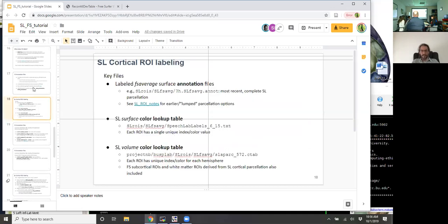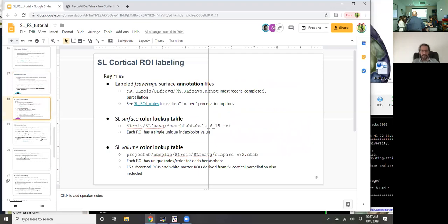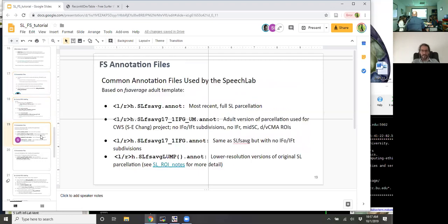Okay, so really quickly here, I'm going to hold this to right around 11 because everybody's got a lot to be doing here. We've basically been talking about color tables, I guess, most of today, and the fact that you can play around with that script. And I was going to talk about the things in the script a little bit more, but we won't do that.